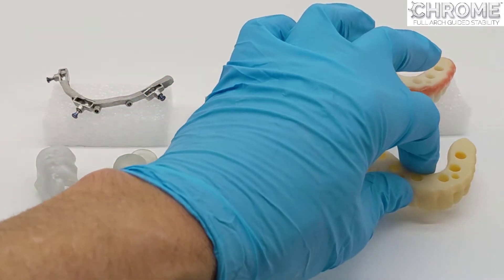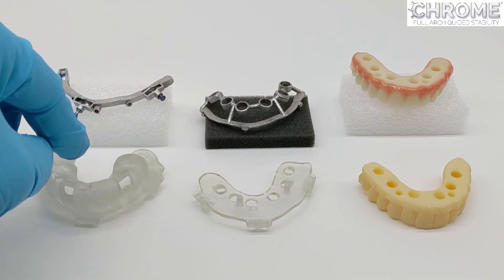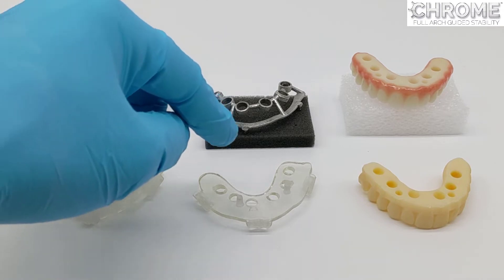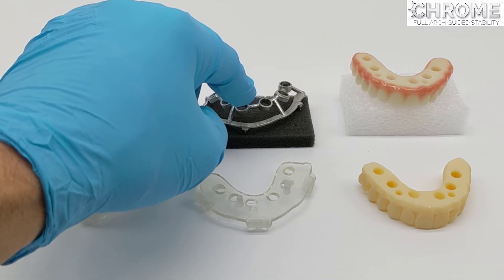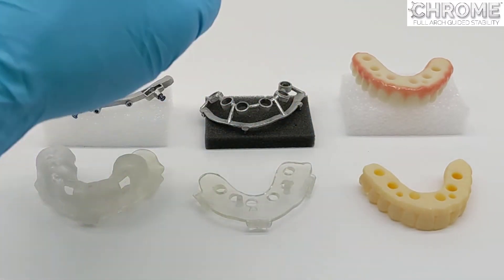So in summary, the components are: pin guide, fixation base, carrier guide, osteotomy guide, rapid appliance, duplicate pickup, and long-term prosthetic.